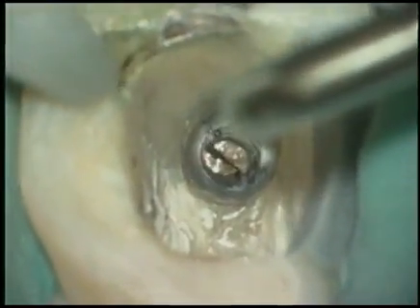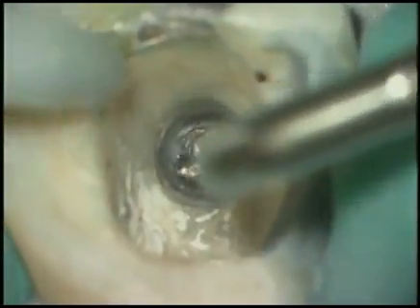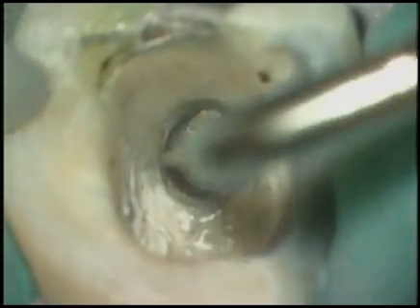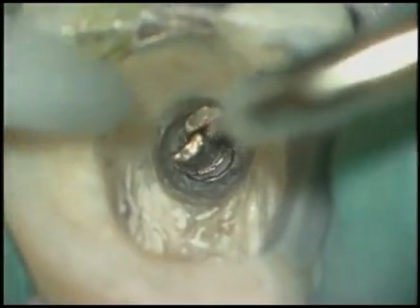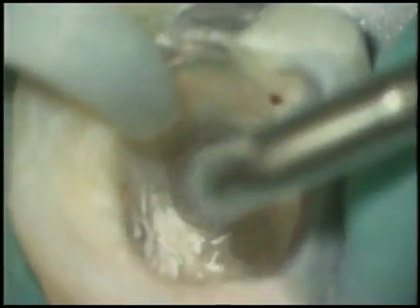When the post begins to move like this and vibrate, we know it's just a matter of moments before it'll be liberated from the root canal system. Progressively move around the post in a counterclockwise motion, and that will generate the energy necessary to move those flexi post halves and blow them out. It is axiomatic that cement will lie apical to the post. Eliminate it with ultrasonics. Now refer to another tape in the retreatment series on gutta percha removal.